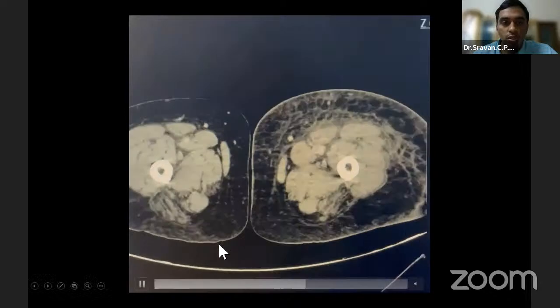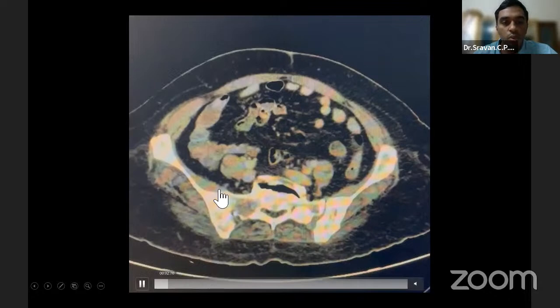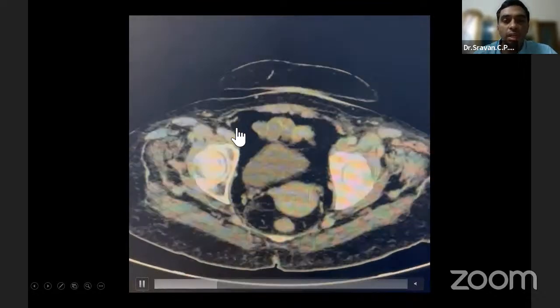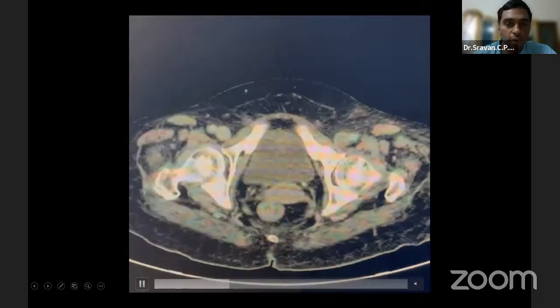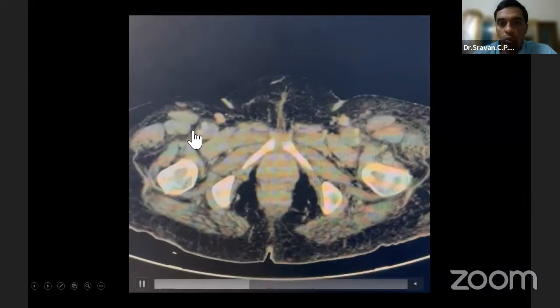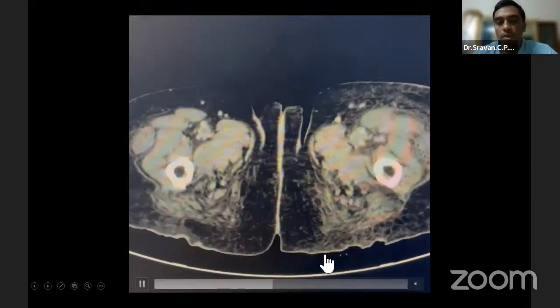If you notice, she also had an asymptomatic DVT on the other side. She has no history of any other DVT related or limb related complaints previously, but you can see that the other side superficial femoral vein is also occluded, but it is a completely chronic occlusion.